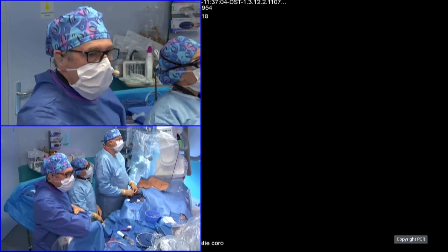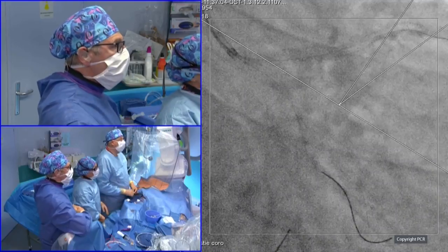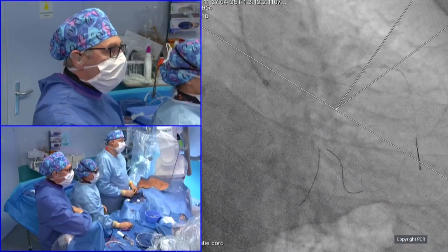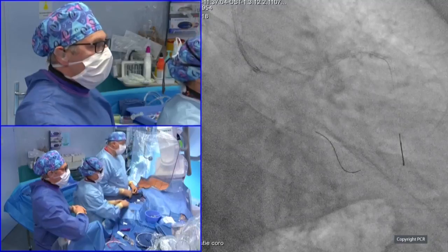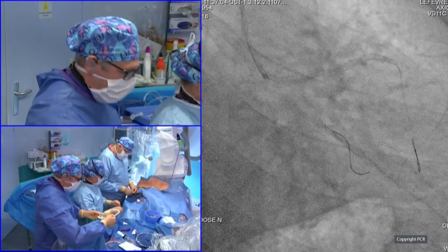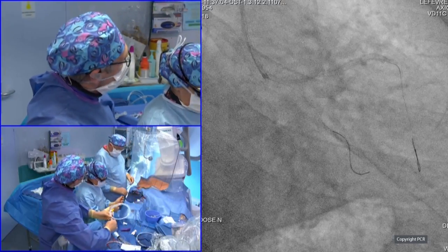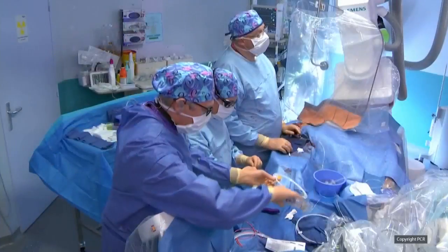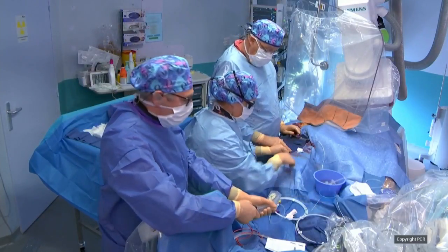And so now we have to take care. Yeah, so now it's very visible that they are not at the same place. So what we have selected for the kissing is... Thank you, Marie-Claude. So we'll use a 3.5 non-compliant. Do you want a 2 non-compliant, Bernard? No, I think we can put our semi-compliant in the LAD because we are inside the stent. Alors, 3.5, no problem for that.